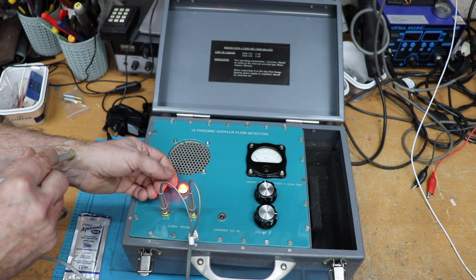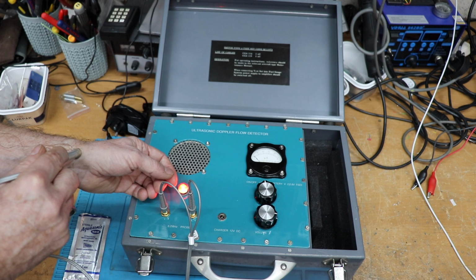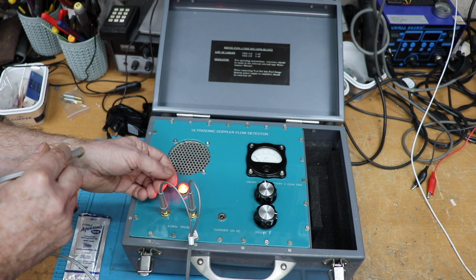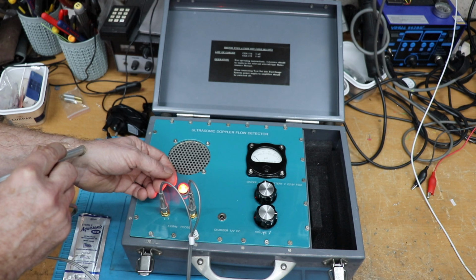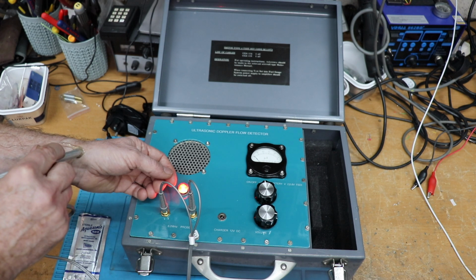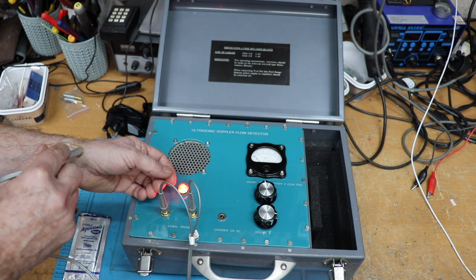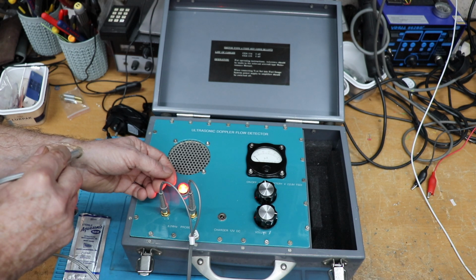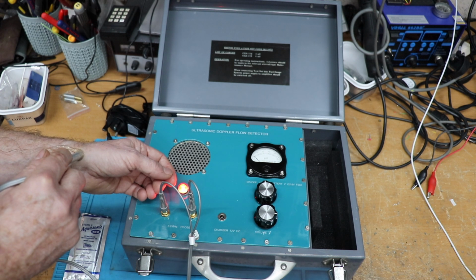So we can just trace the radial artery all the way around here actually. And one of the things you look for when you examine, or when you get experience of doing this, is you can listen to the quality of the waveform. I mean, some of these machines have recorders and visual representations of the actual waveform.